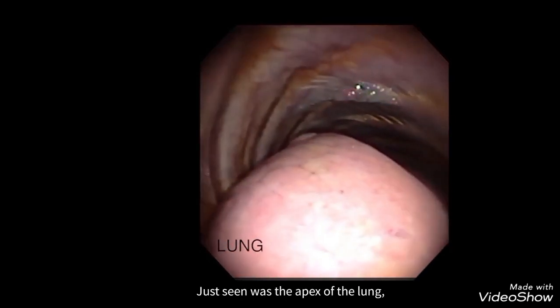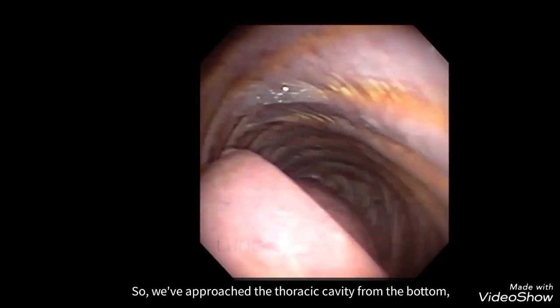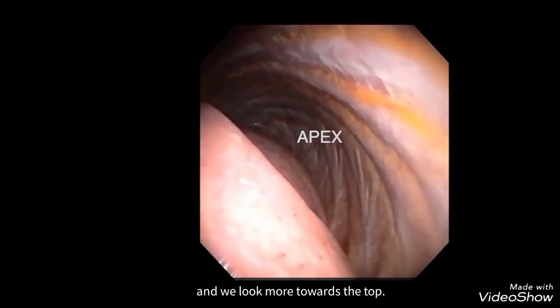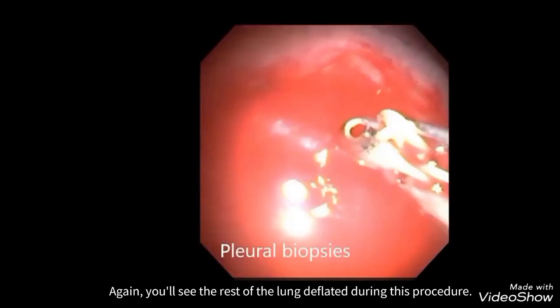Just seen was the apex of the lung off in the distance, so we've approached the thoracic cavity from the bottom, and we look more towards the top. Again, you'll see the rest of the lung deflated during this procedure.